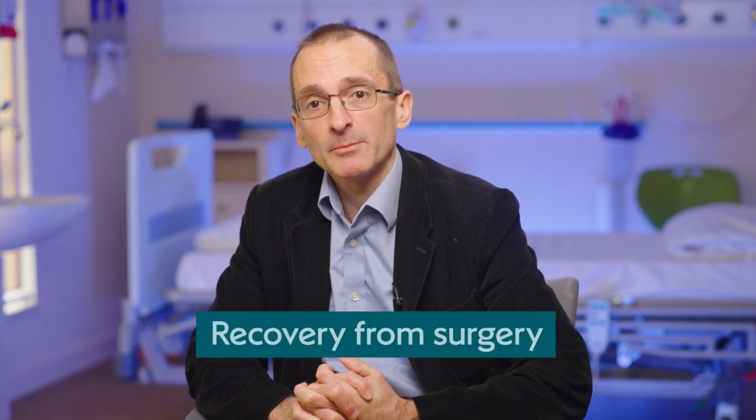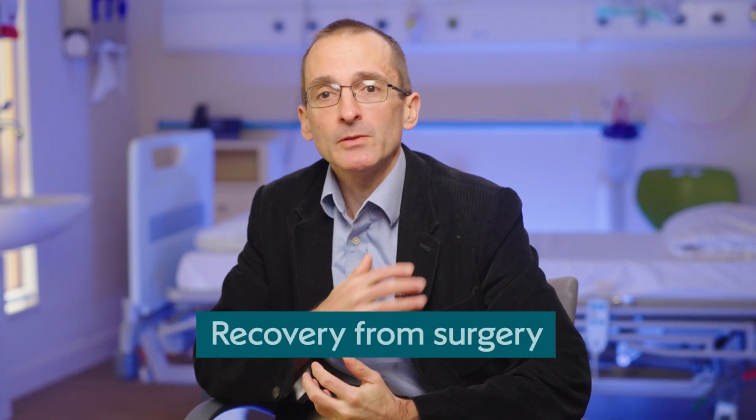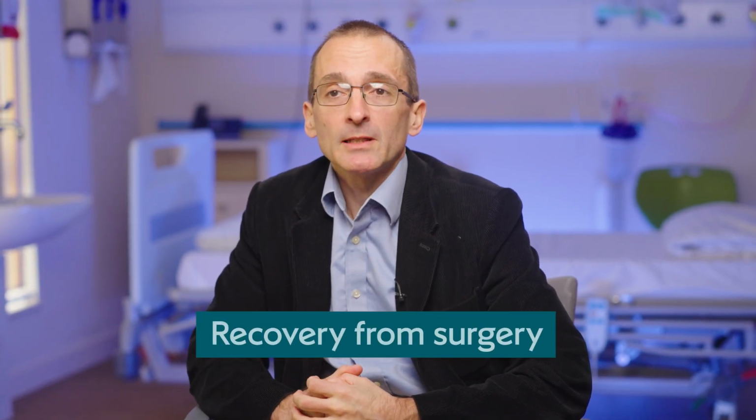Once a pacemaker is implanted, there are some checks that we need to do later on that day, including a chest x-ray and an interrogation of the device. And if those are satisfactory, people are generally allowed to go home. Recovery after pacemaker implantation is mostly about the wound, so we don't want people doing anything too vigorous with their left arm, particularly above about 90 degrees at the shoulder, for maybe 6 weeks afterwards.